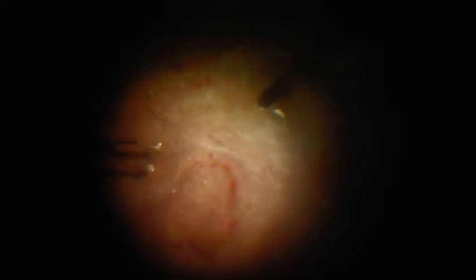Here you can see a taut posterior hyaloid face with at least some separation from the retina. The 27-gauge vitreous cutter is deployed for delaminating, cutting, as well as segmenting the posterior hyaloid attachments quickly without having to deploy any other instrument at all, and all this with minimal traction on the fibrovascular proliferations.